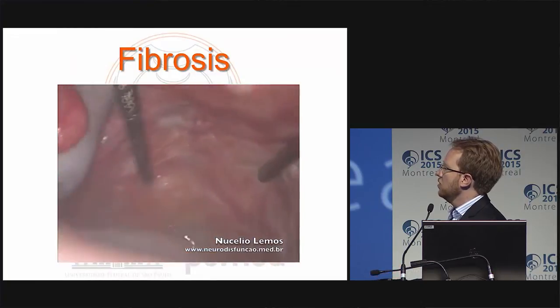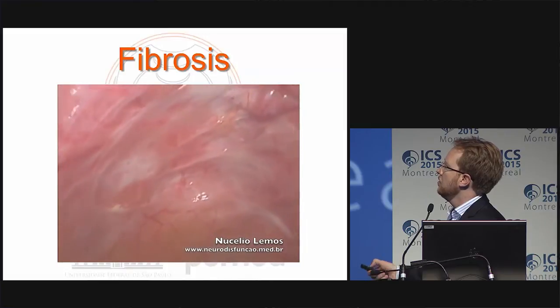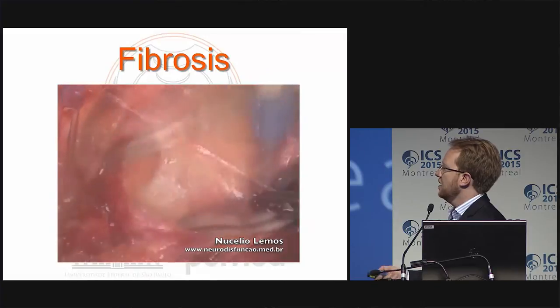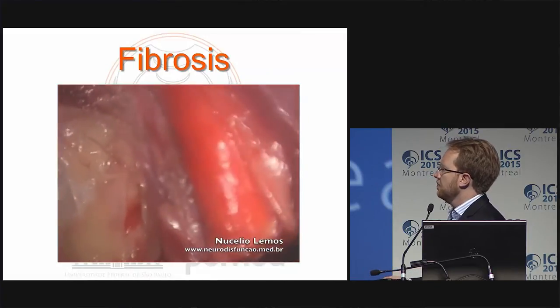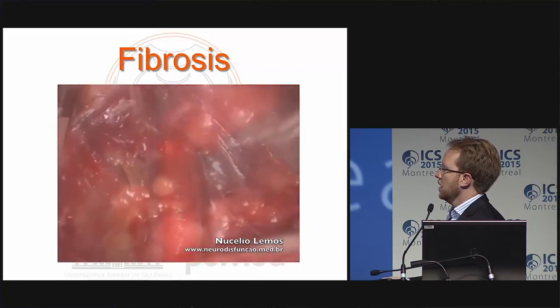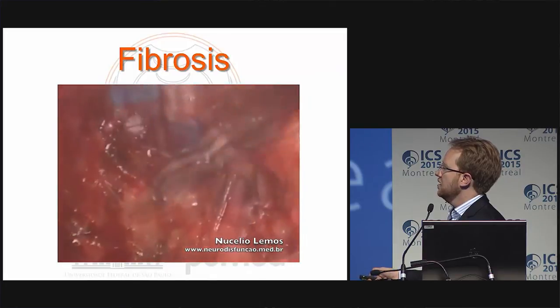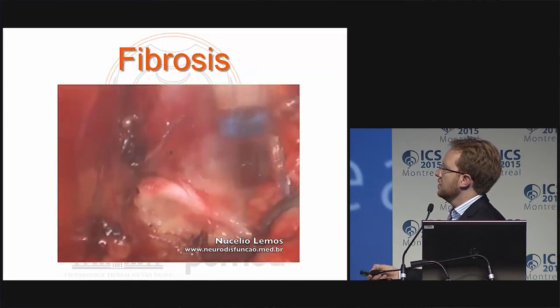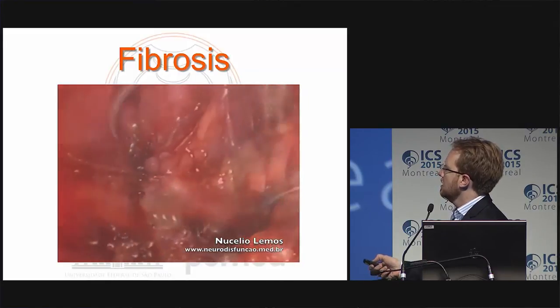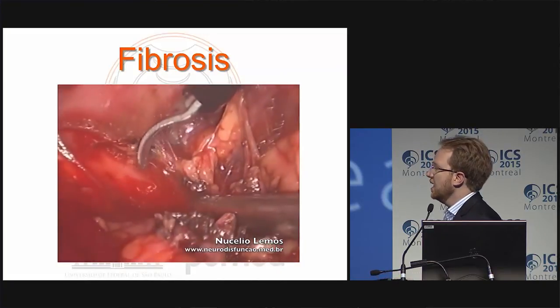We can also have fibrosis — secondary to endometriosis in this case. There was a radical resection here; you can still see the peritoneal scar. The patient had sciatica, perineal pain, and urinary urgency. Going to the nerve, we can already see the fibrotic tissue, and instead of the healthy fatty tissue seen in other dissections, there is fibrotic tissue that limits the movements of the sciatic nerve.